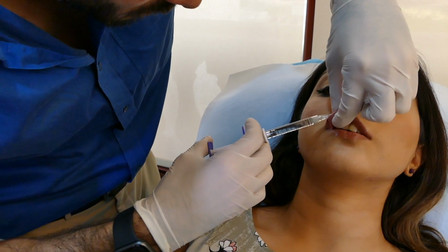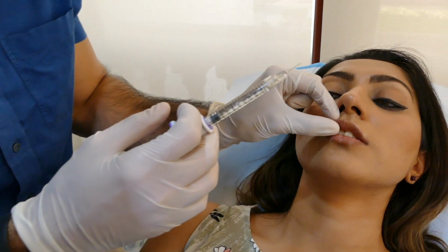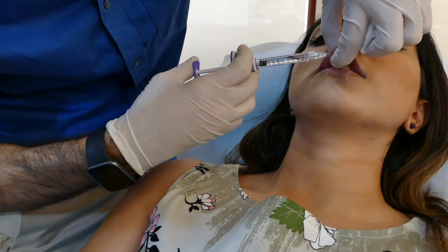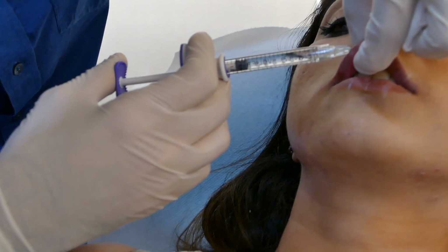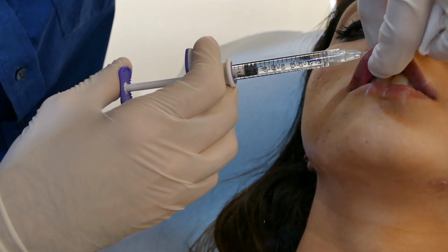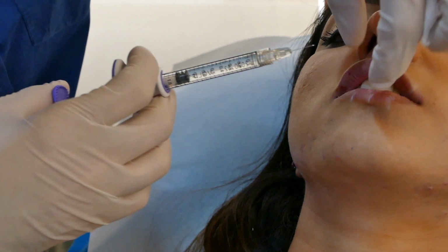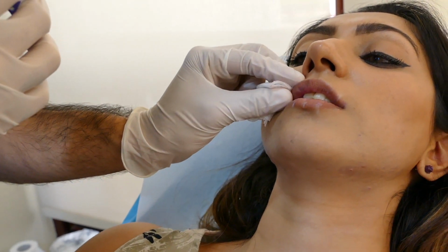Again same in the intramuscular plane with gradual withdrawal technique. Then injecting the central tubercle of the lip. The bimanual pinching allows proper placement of needle in the superficial depth of the orbicularis muscle. The labial artery is on the wet side of the upper lip, underneath the mucosa over the orbicularis muscle.